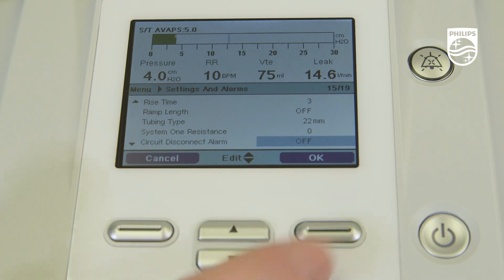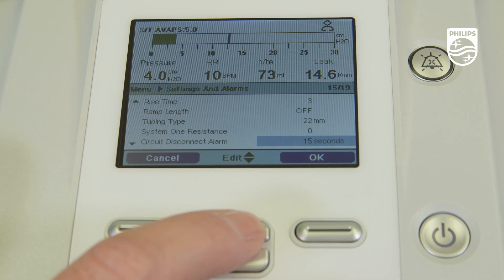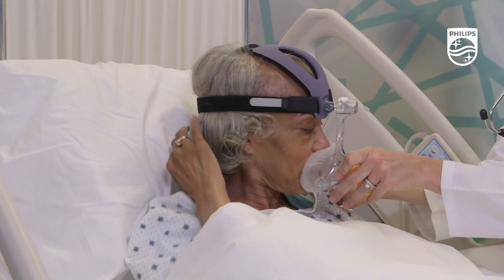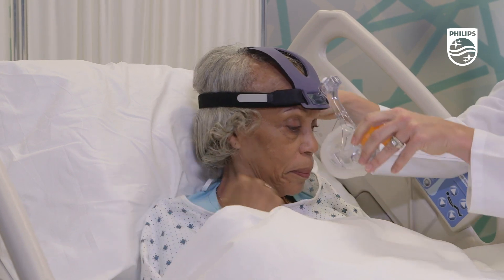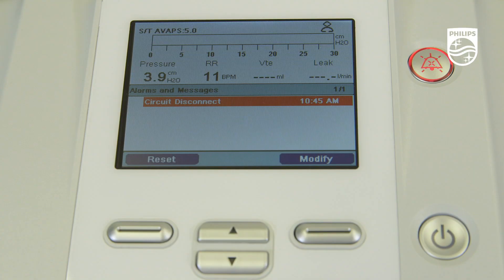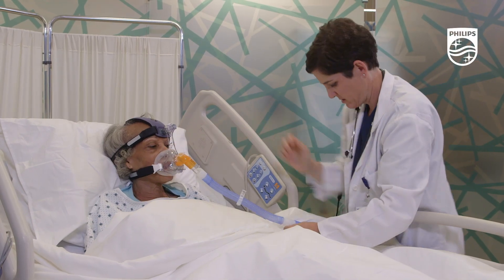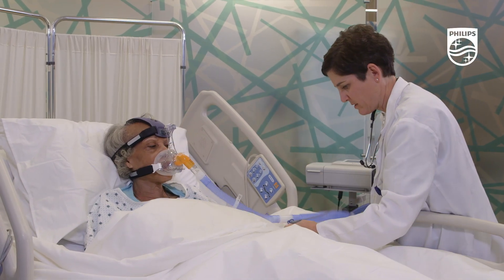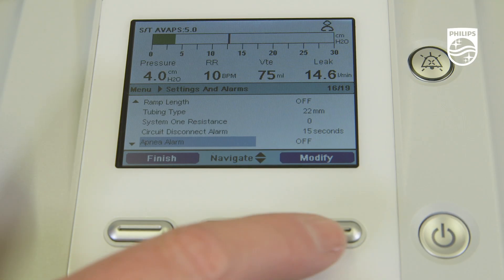you first come to the circuit disconnect alarm. When a large continuous air leak is detected in the circuit, such as the patient's mask being removed during therapy, this high priority audible alarm will sound. The audible alarm will terminate once the leak is corrected.